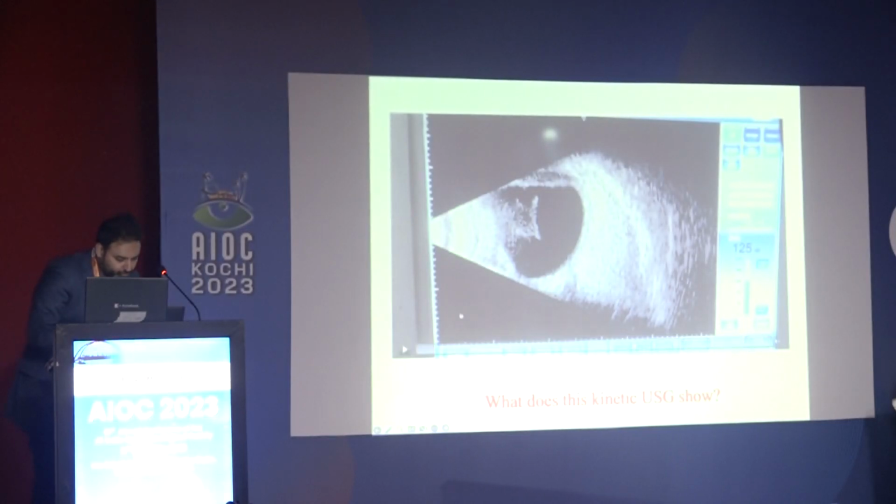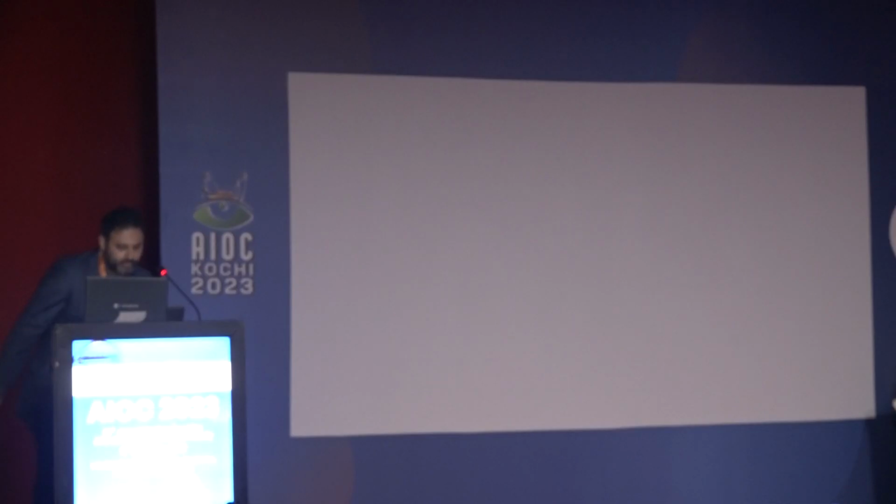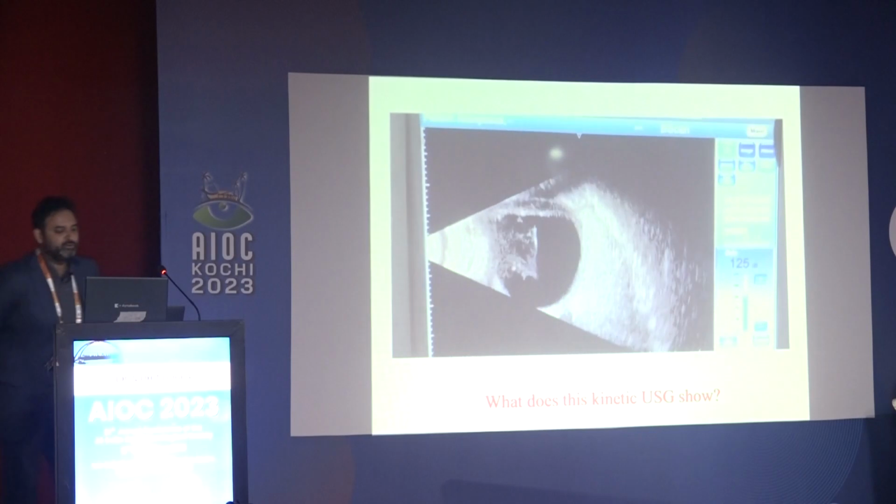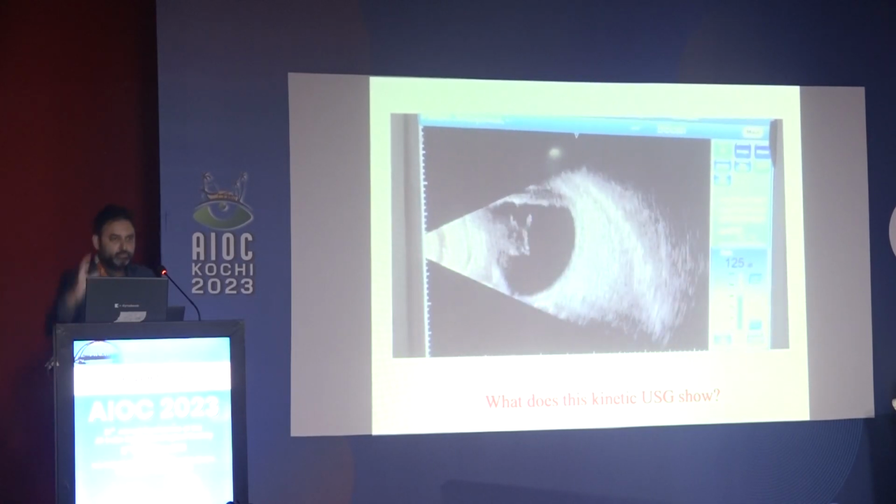And I'm just going to show one kinetic ultrasound. Once I realized my videos aren't working, I introduced one more. So this is a 30-second video, and I'm going to stop after this. I'm asking the patient to look up and down, and you'll see that the globe is moving.